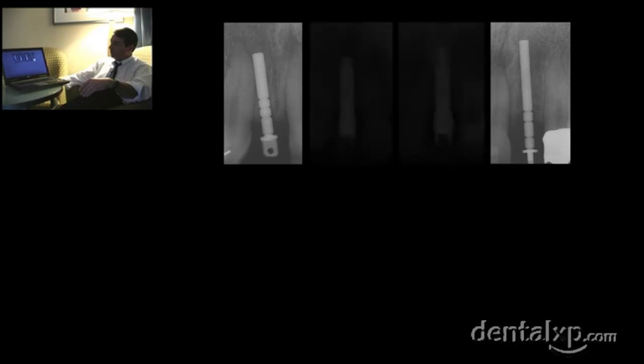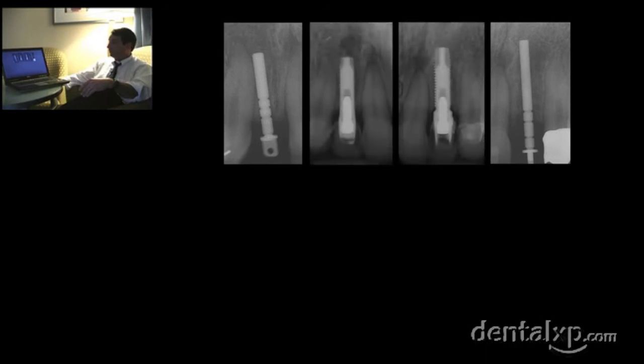As you can see, we straightened that out, but we used 3.25 implants for both of these, and we provisionalized them in this radiograph. Then the next phase of care is provisionalization.